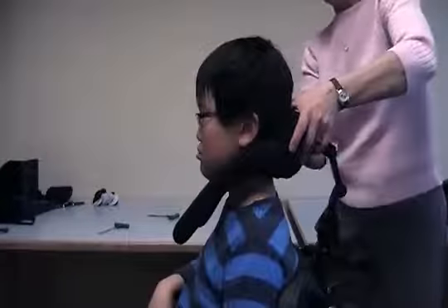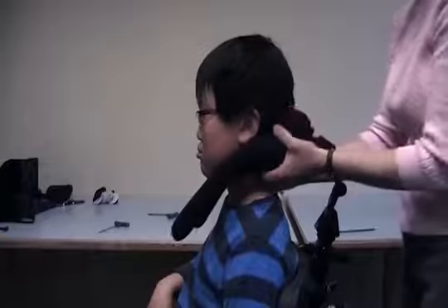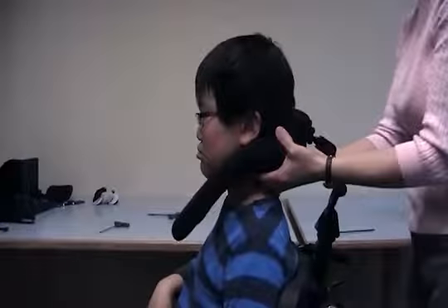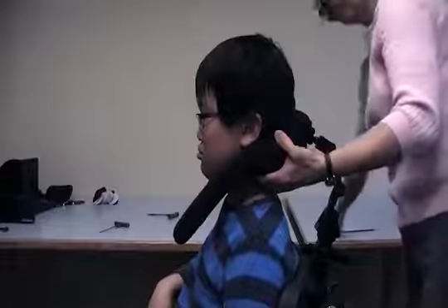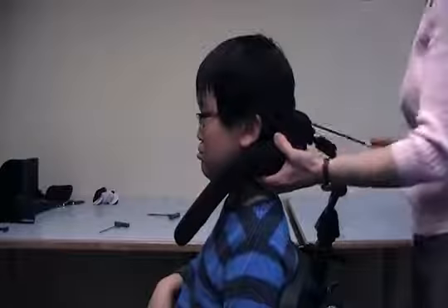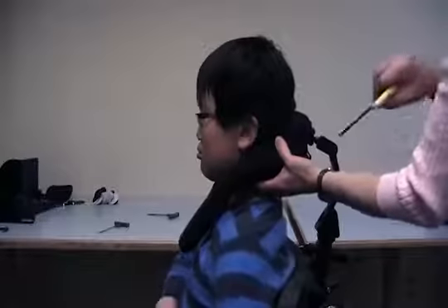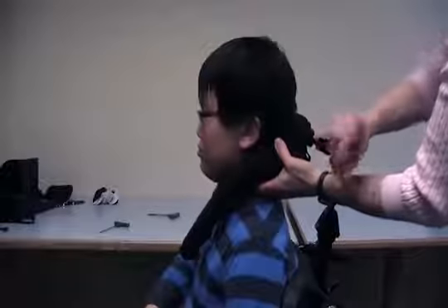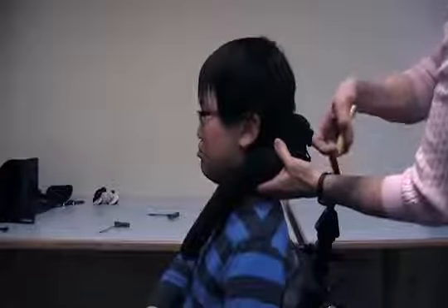Bring the suboccipital piece right up to that area of the skull. Once this is in position, each of these links can be tightened.